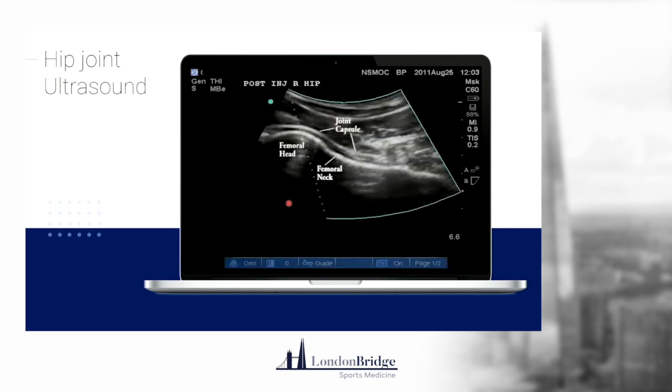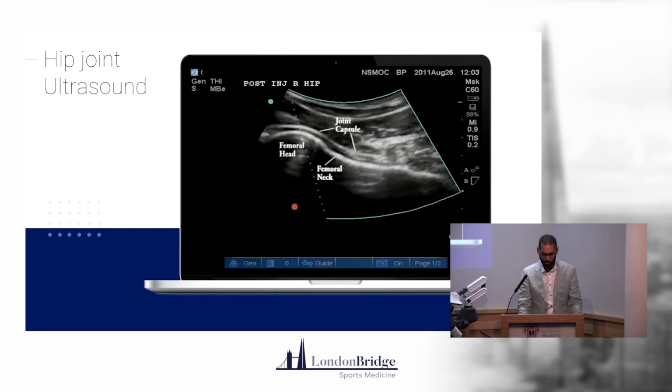I've just got a couple of videos to show you. Hopefully that's playing. Are we playing now? So this is a hip joint. You can see the femoral head, the femoral neck. This is the capsule as well. Oh, now it's playing, sorry.